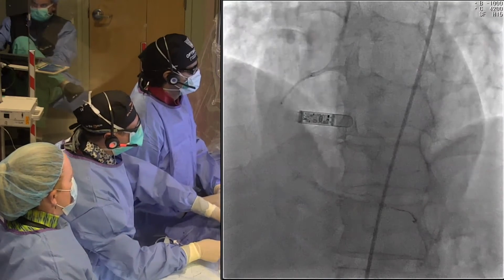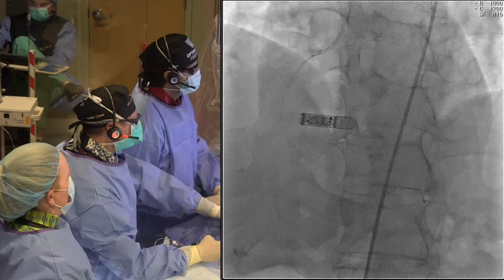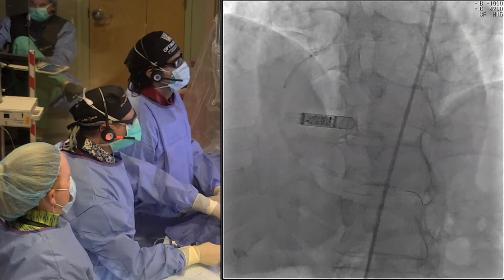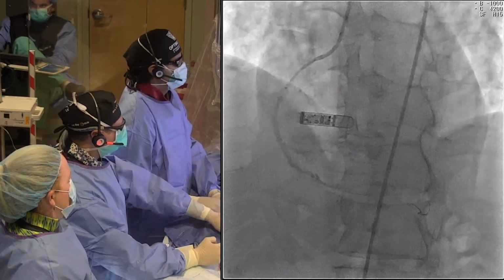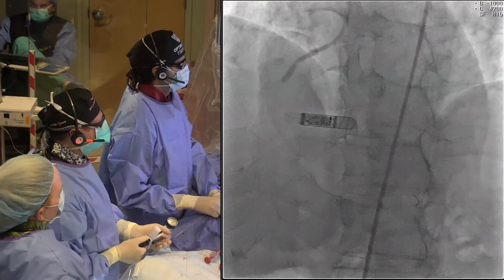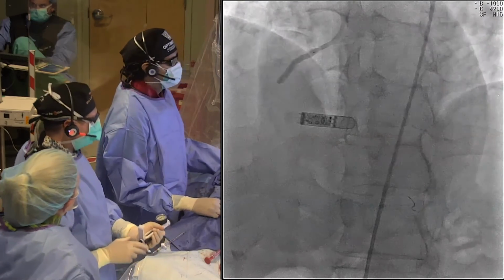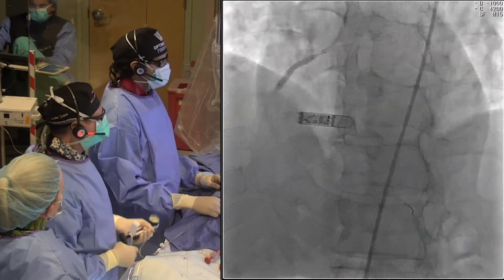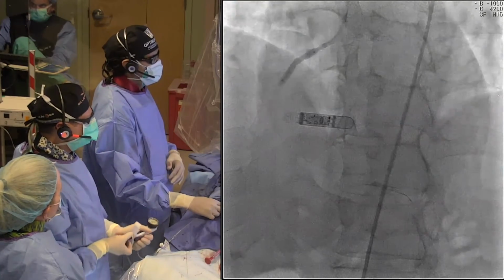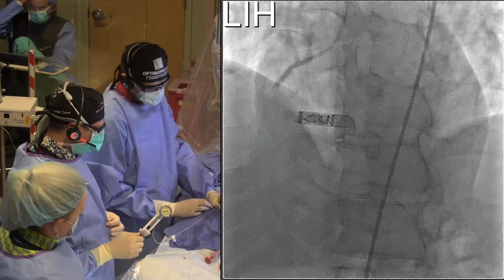Okay, you want to take a little? Come back more. All right, now pull the stent back. How about our stent boost? I can come back even a little bit more. More room. I'm going to go ahead and take that. Okay. Wow, look at that, huh? Let's go high. 16, 18. We are at 18. Great. And down. It's not fully expanded here. We're going to just post-dilate the whole thing a little bit, huh?